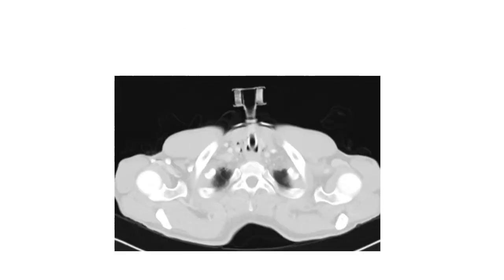Here is the lung window, which shows no lesions at this point of time.